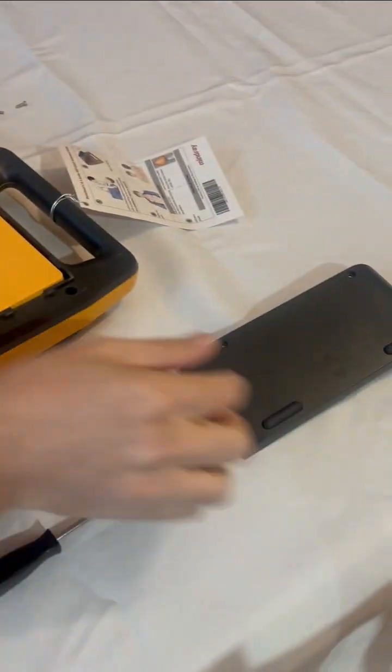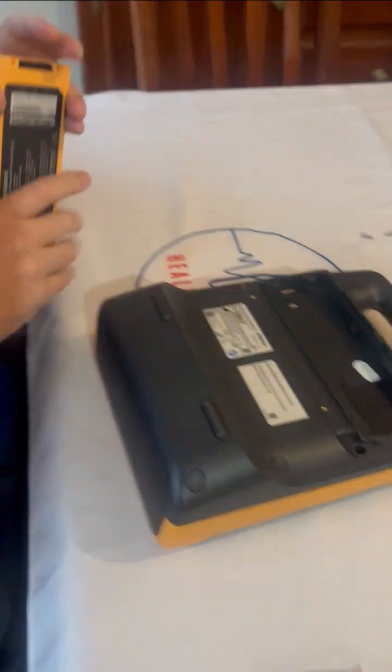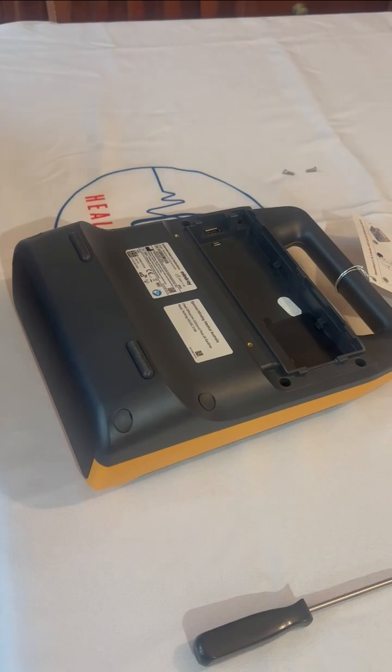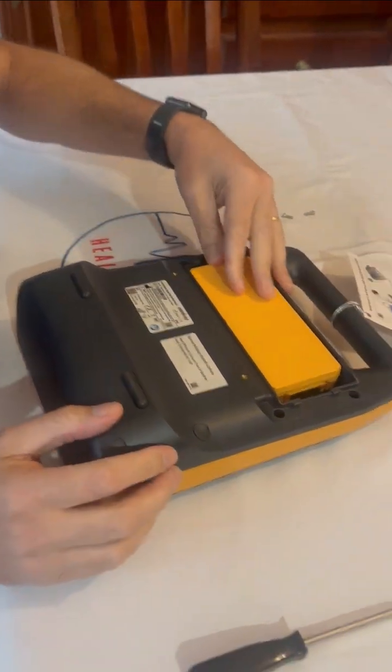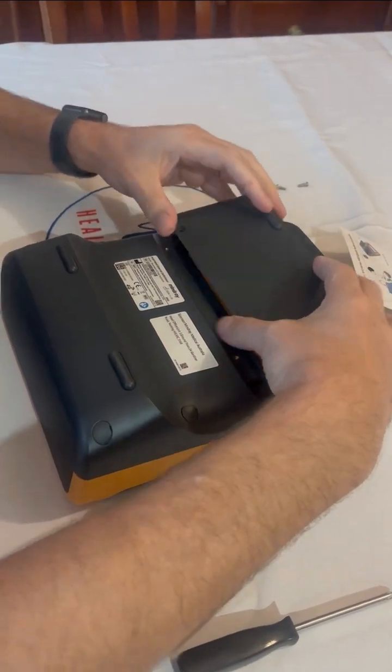Once the screws are removed, gently lift the cover to access the battery. Take your new battery and align it with the compartment. Slide it in securely, ensuring proper connection.